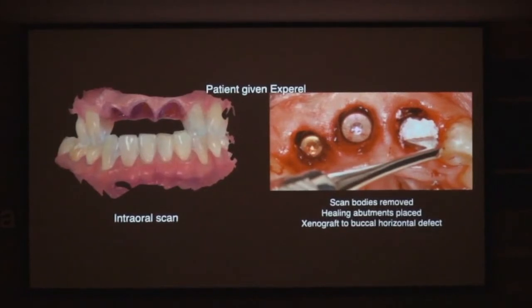Now this patient has nice thick tissue and thick bone, so this is an ideal immediate case because I know it's not going to change a lot. It's not a super thin bone tissue profile.